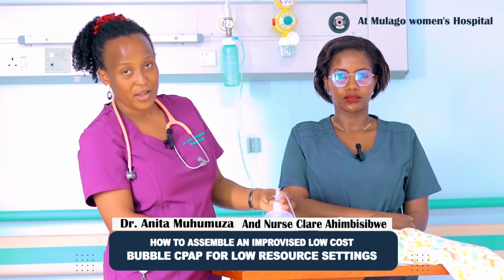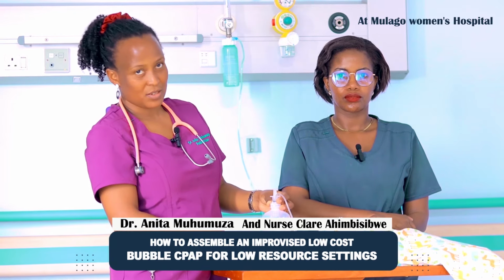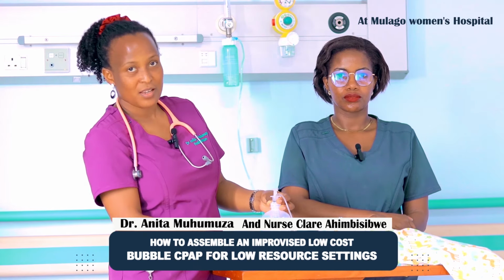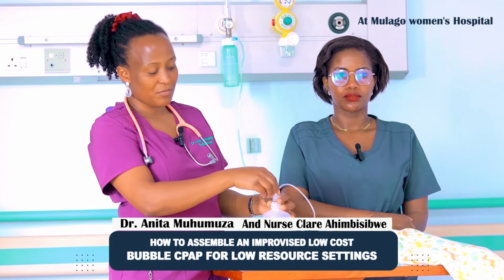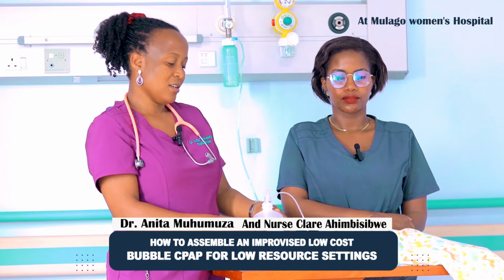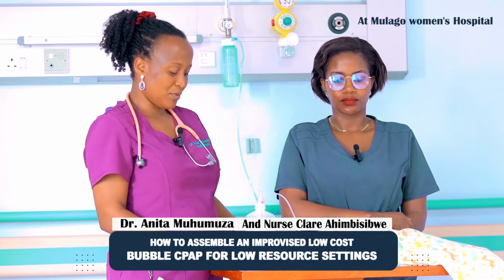So we started from 5. If the baby is not improving, we can increase the PEEP maybe to 6. Even for some preterms, we can start from 6 or 7. As they get better, we keep on reducing the PEEP as they improve. So this can be adjusted by adjusting the length of the tube in the water, and that adjusts the PEEP that we are giving. CPAP is also related with some complications that we are going to hear about.